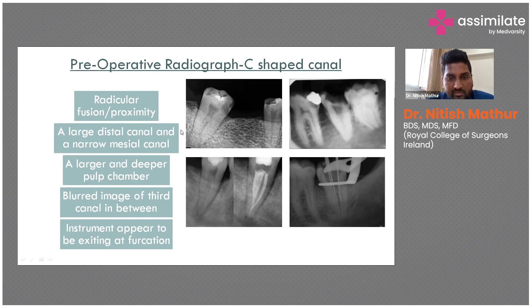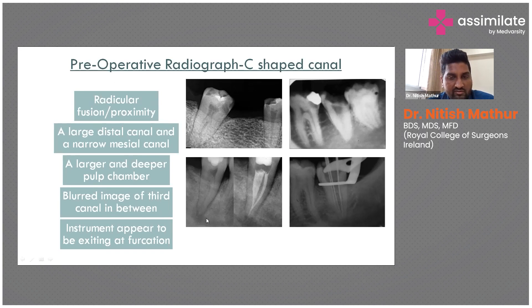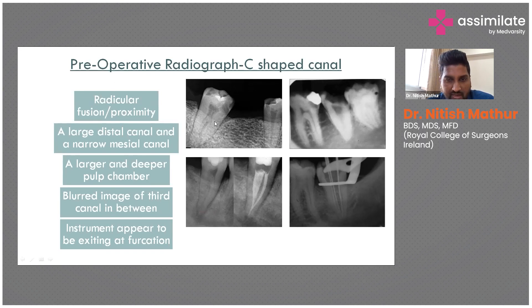The features are: radicular fusion or proximity of roots; a large distal canal with a small, narrow mesial canal; a deep and larger pulp chamber; and a blurred image of a third canal in between. These appear very frequently in C-shaped canals.